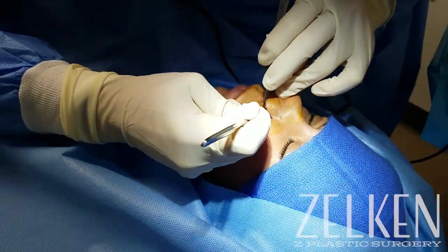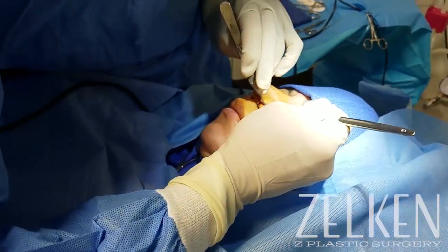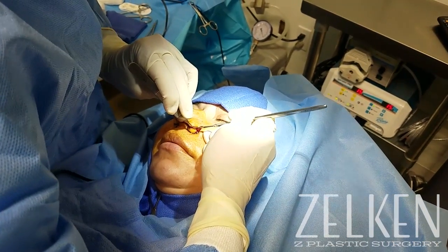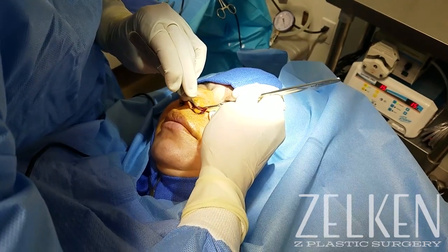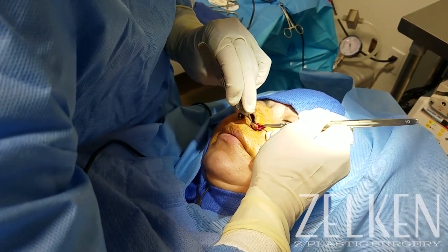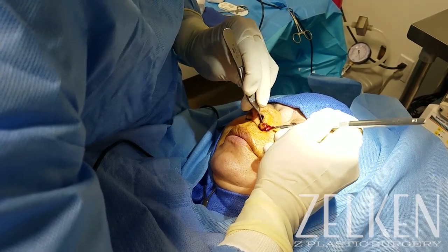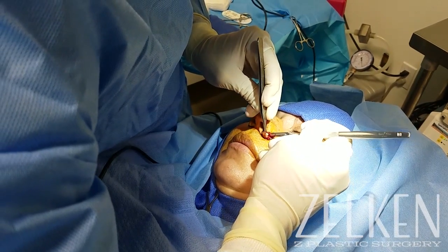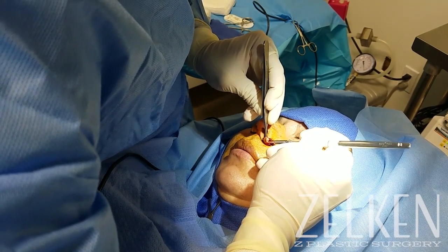Once the patient is comfortable and relaxed, it really should be like a spa environment for the patient. Even though there's going to be some pressure that she feels, possibly some sense that she smells and some sounds that she hears, the procedure should be very well tolerated. If the patient is uncomfortable whatsoever, stop, apply more vasoconstrictor, and then resume after the vasoconstrictor and the numbing medication have time to take effect.